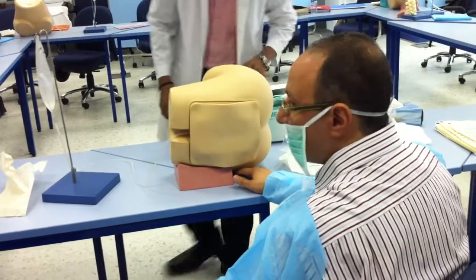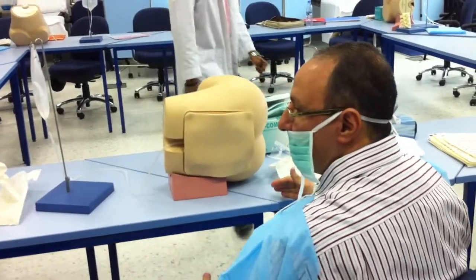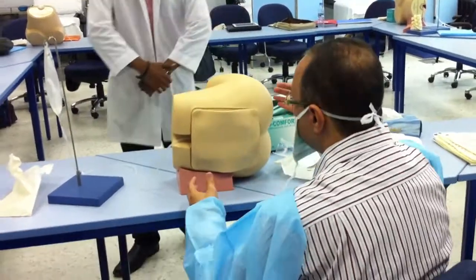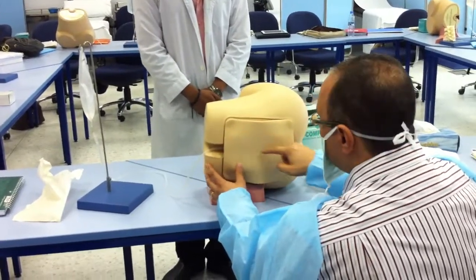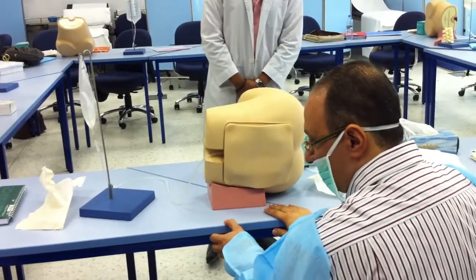This is called a left lateral position, because the right side is directed upward. The patient will sit in the fetal position. The fetal position means his chin is touching his chest and the knees are flexed towards his abdomen. This creates a C-shape on the spine, making the axis of the spine parallel to the table.